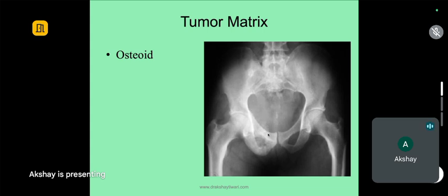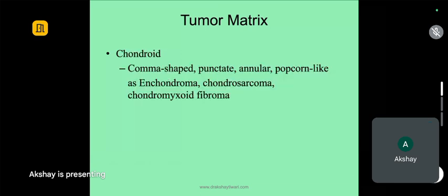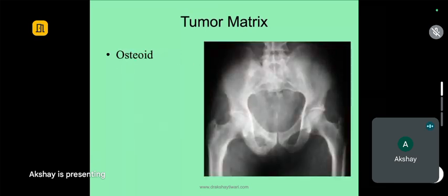But sometimes with X-rays, you could be seeing something that I can't. It has to be the sum total of everything. And obviously, don't say some bizarre thing. If you don't see it, say a little less, okay?